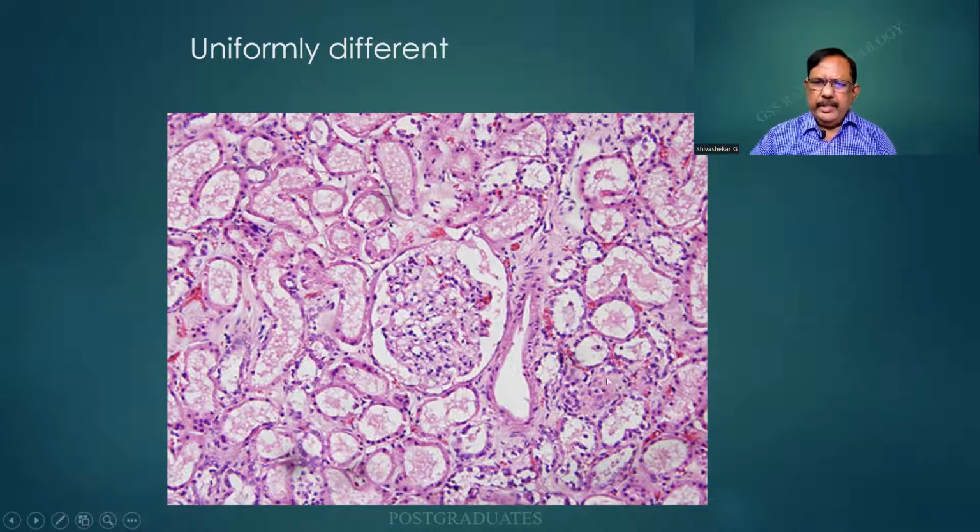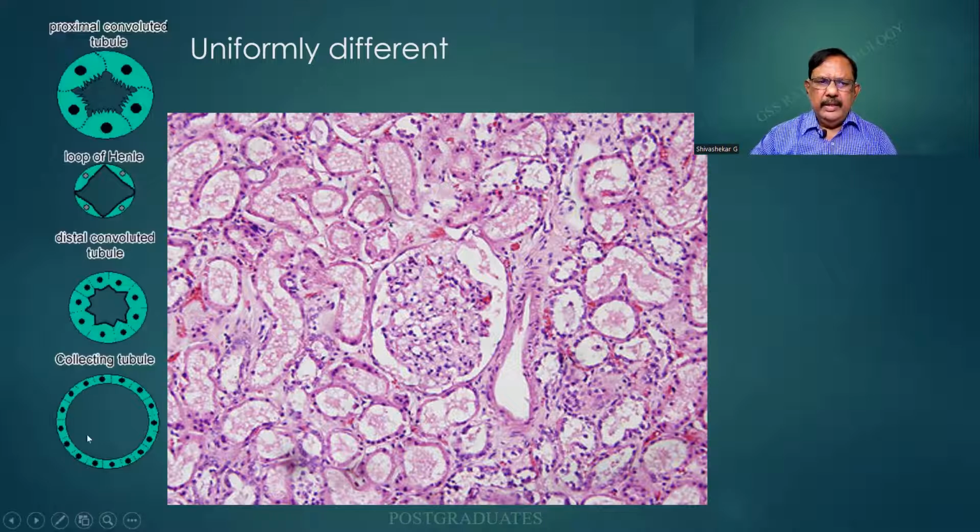And this will be the interstitium. Generally, there will be a back-to-back arrangement of the tubules, but then there can be an interstitial widening in edema, there can be a fibrosis, there can be an inflammatory infiltrate, which will be altering the morphology. And look at this over here. This is of great importance. Incidentally, students, I would like you to kindly apply it in the difference between the adult and the infantile cystic kidneys, polycystic kidney. You find that there will be a difference in the lining epithelium.